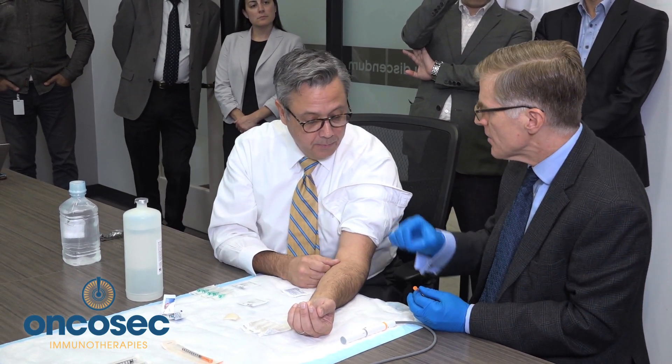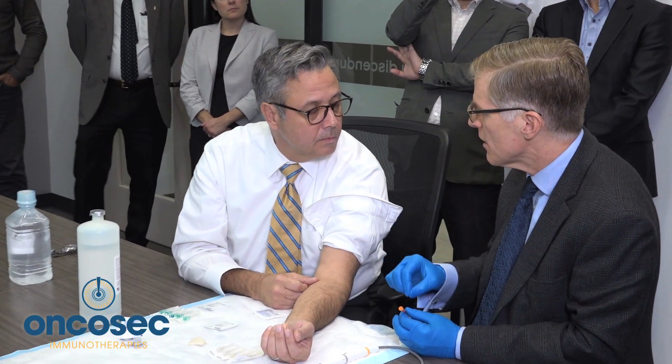What happens is the cells take up the plasmid. There are holes made in the cell membrane by the electroporation. The cell takes up the plasmid, and then there's a promoter on that circular DNA, and it will make IL-12. We've given cytokines by vein where they're administered to the entire body, but it's not a very efficient way to do things — it's very toxic. People get very sick, and not much medicine is actually delivered into the tumor. Here, we're getting high levels of cytokine in the tumor microenvironment with very minimal exposure in the rest of the body. The tumor will express IL-12 right where it's needed for about a week at a time.